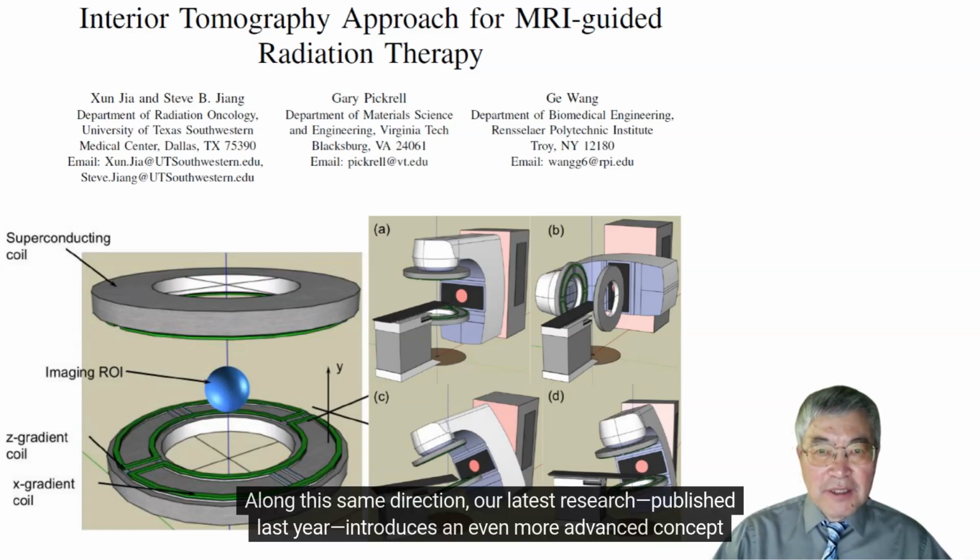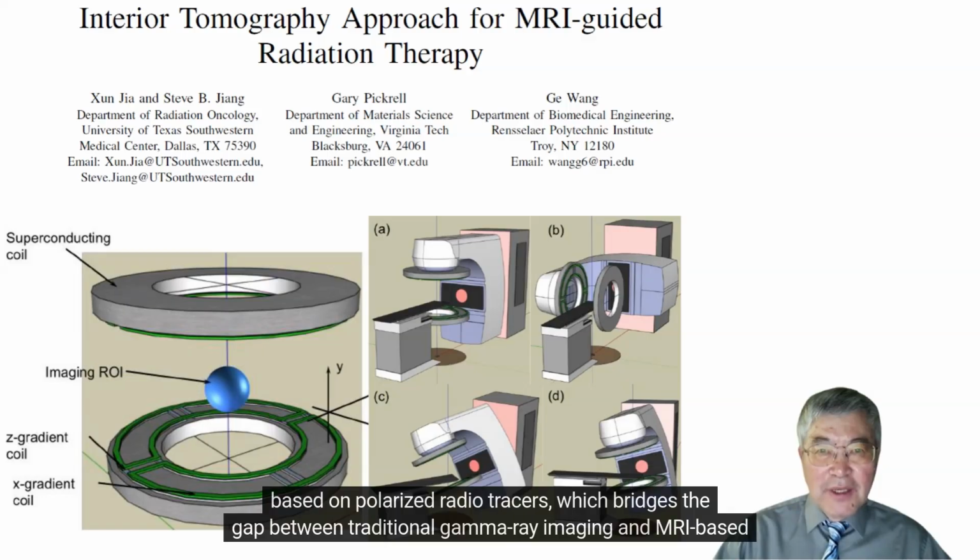Along this same direction, our latest research, published last year, introduces an even more advanced concept based on polarized radiotracers, which bridges the gap between traditional gamma-ray imaging and MRI-based methods.